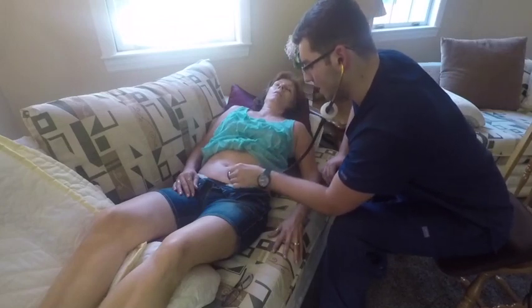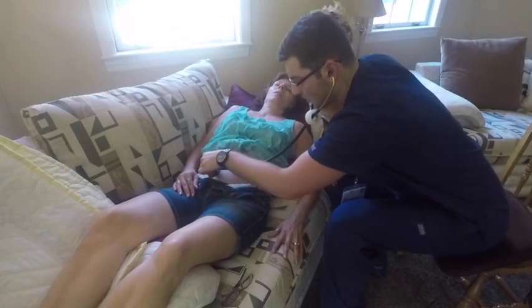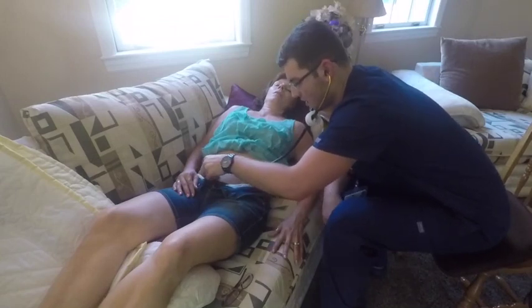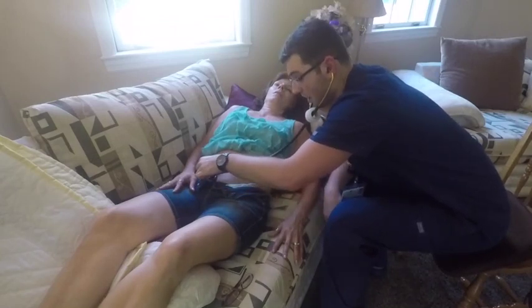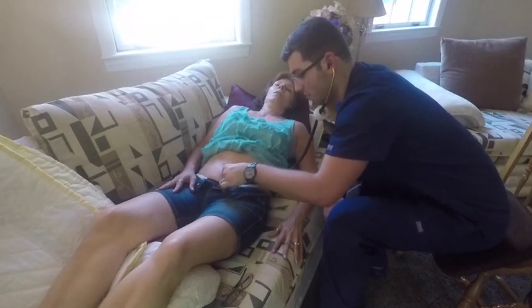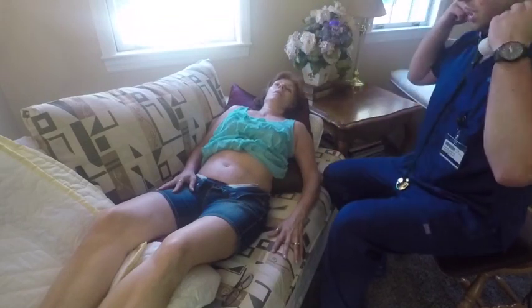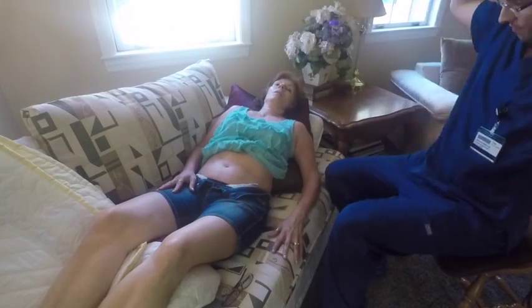I'm going to listen for the left iliac artery and the right iliac artery, and then finally the femoral, the right femoral, and the left femoral. Listening again for any bruits or turbulent blood flow that would indicate to me that there's some sort of occlusion in those arteries, which I do not hear any.